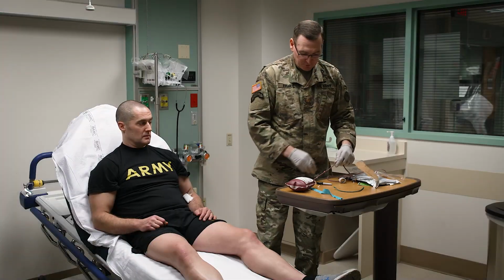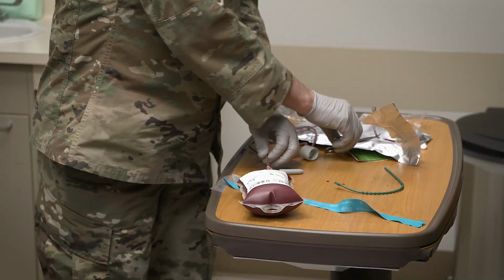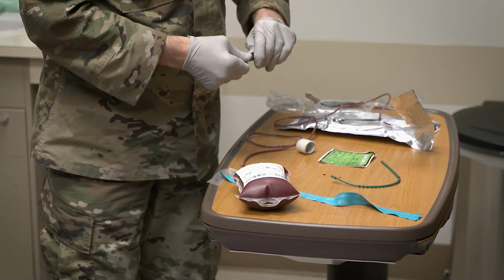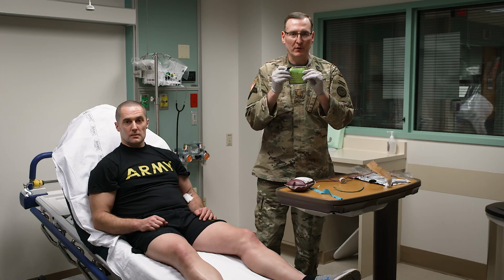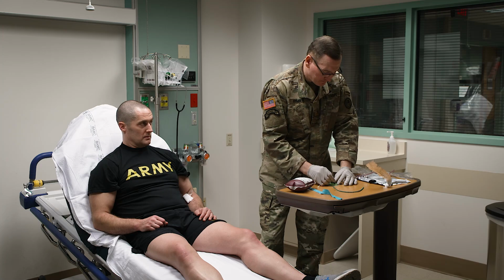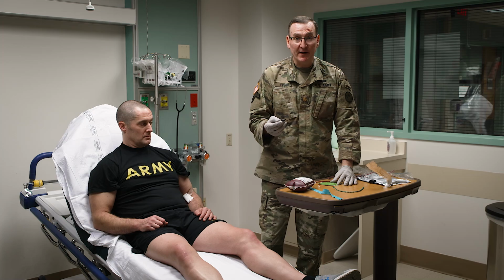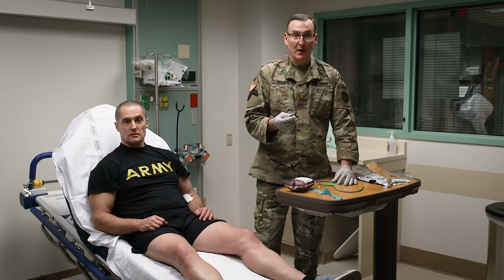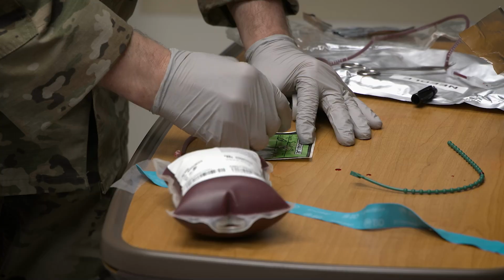Okay, the only thing left to do now is to cut between these 2 marks, these 2 knots, and we will then be able to move on to the transfusion part. Very important. Make sure you fill out your blood bag label, okay? So make sure you have your donor battle roster number, the ABO type that he has. If I didn't have it available, I would use the Eldon card to confirm. But if I have a roster with me, I'll know what type he is.